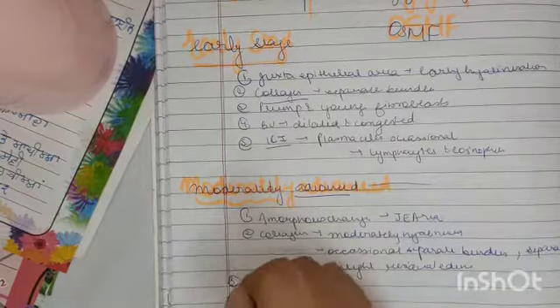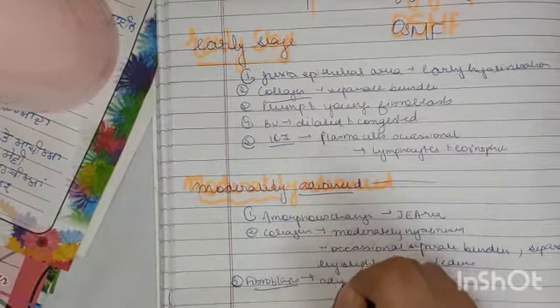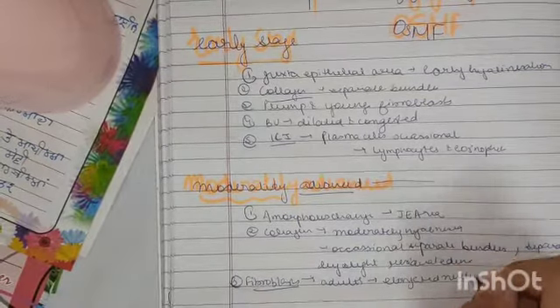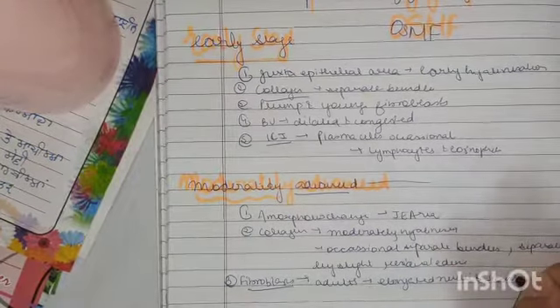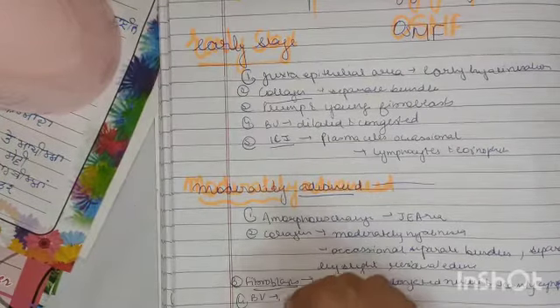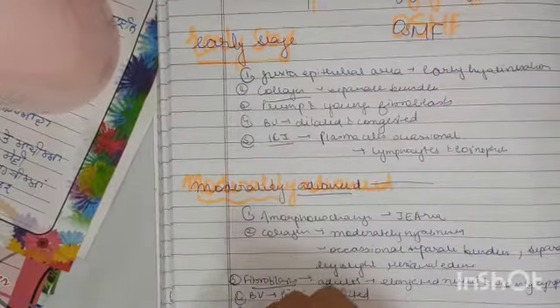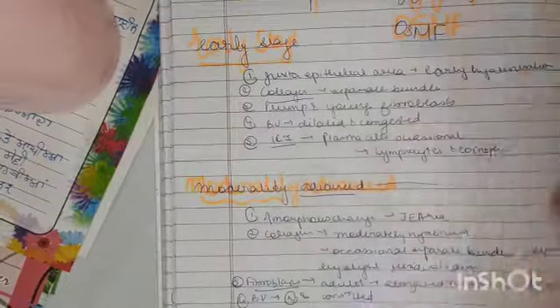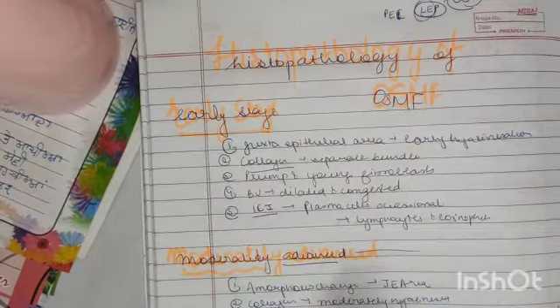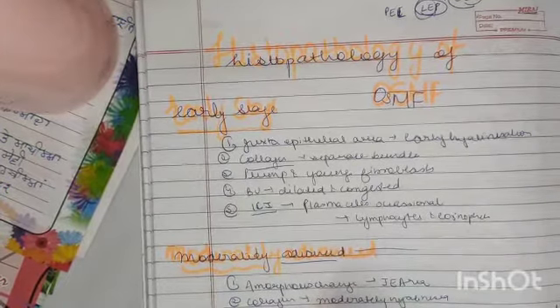Now, what happens is the fibroblasts basically become adults, that is they have elongated nuclei and scanty cytoplasm. The blood vessels are normal and they are constricted. Now in the inflammatory cells, I told you the trick. Now we have E at the second, so we will write eosinophils as being occasional and the rest two being predominant, okay. So eosinophils occasional, and the lymphocytes and plasma cells being predominant.